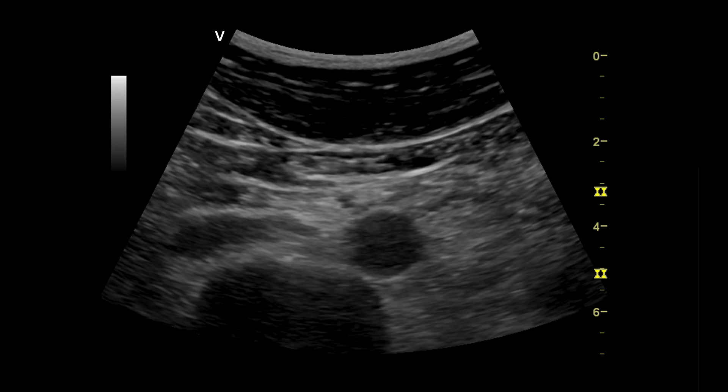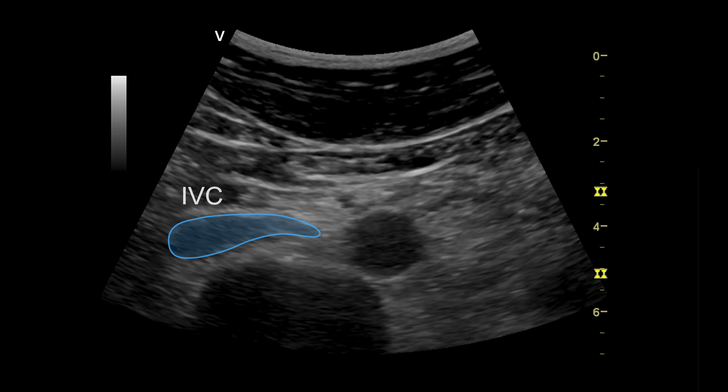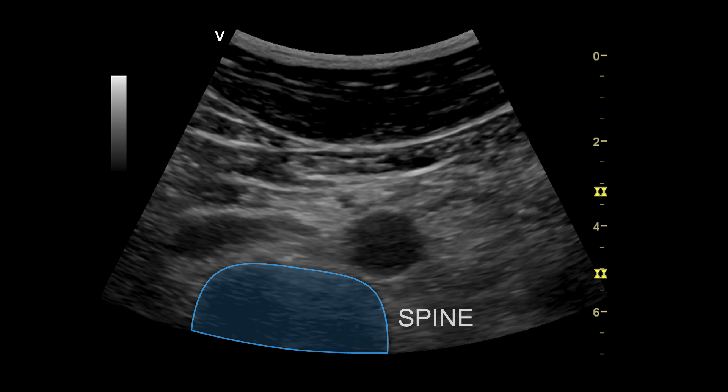In this mid-transverse view of the abdominal aorta, note its position in relation to the inferior vena cava and the spine.